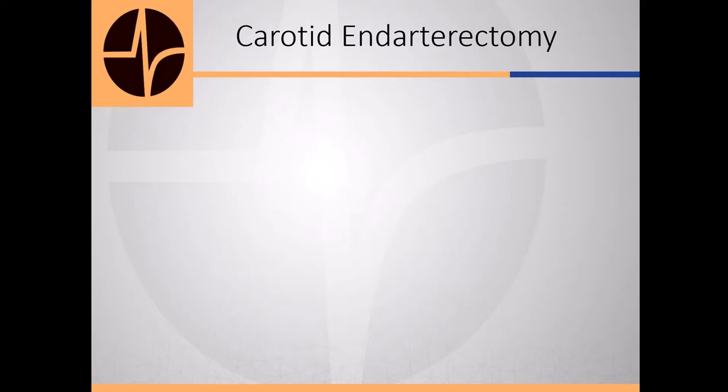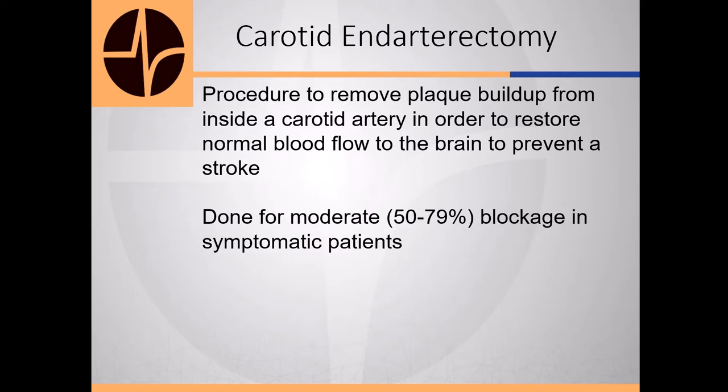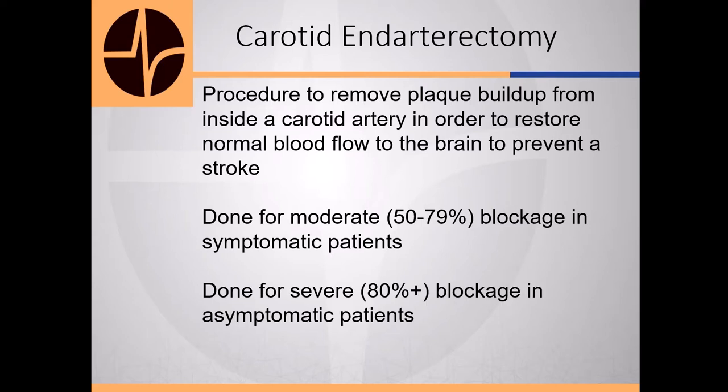Carotid endarterectomy. It's a procedure to remove plaque buildup from inside a carotid artery to restore normal blood flow. It is done for moderate 50 to 79% blockage in a symptomatic patient or 80+ percent blockage in asymptomatic patients. The symptoms will include strokes or TIAs.